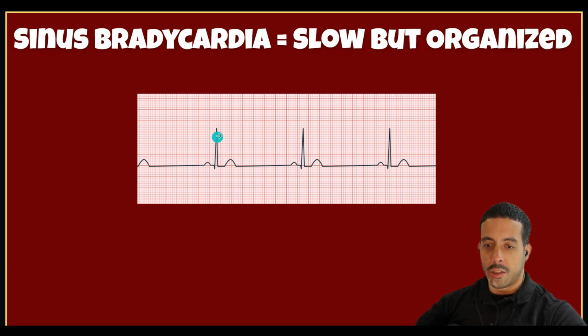The morphology of all the waves, it's normal. What's not normal here is the distance between one R wave and the next. So, when a person has sinus bradycardia, in the majority of cases, this is normal.